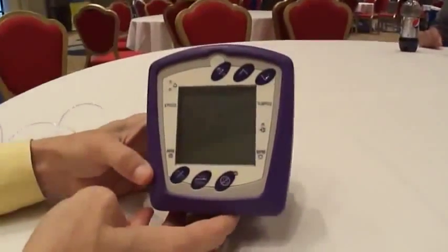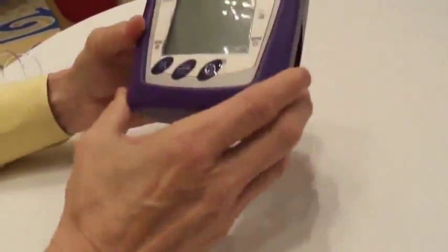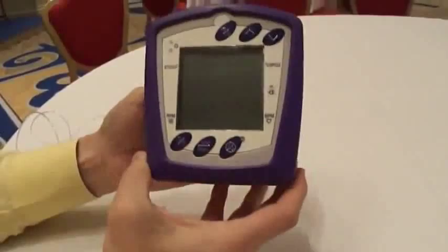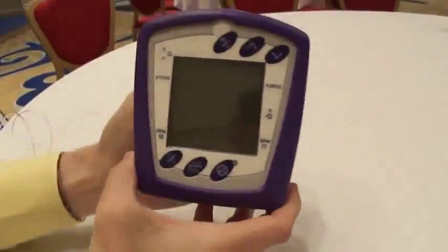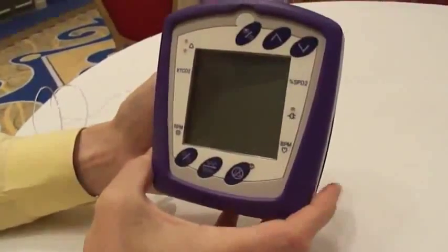Hey Chris, this is the Kapnacek 2 End-tidal CO2 monitor from BCI. Basically there's a couple things to the unit. The unit comes like this with a purple rubber boot on it. You also get with it a battery and a battery charger.